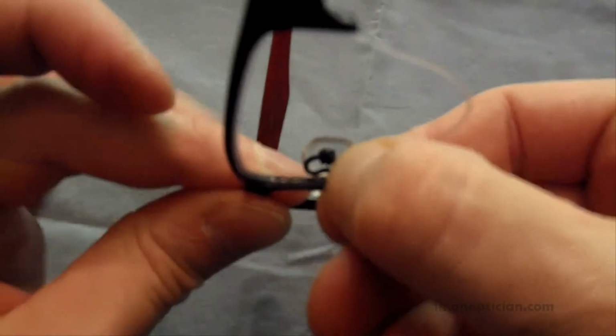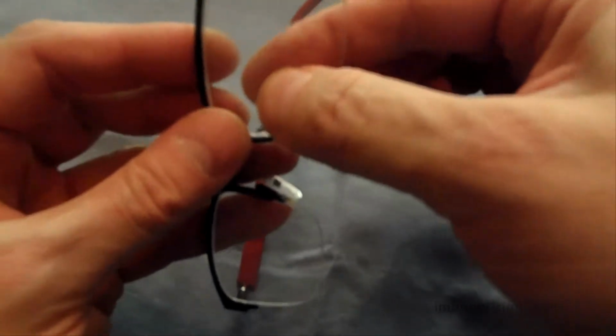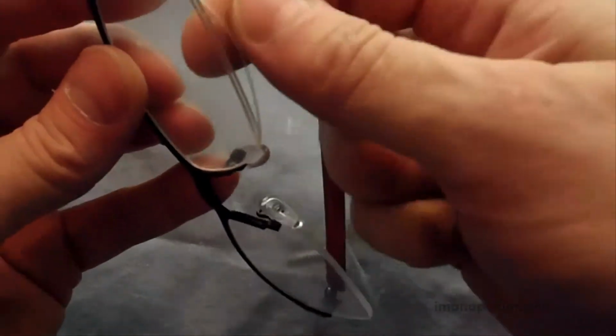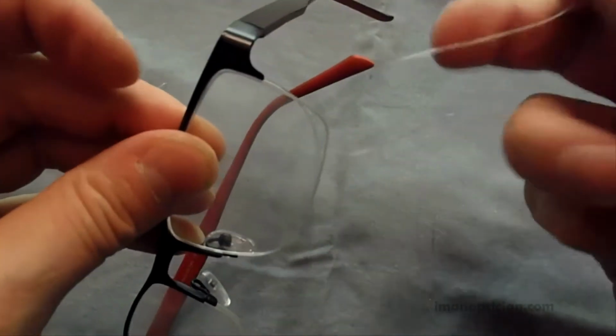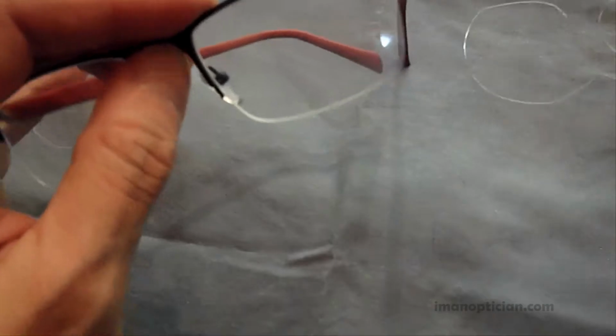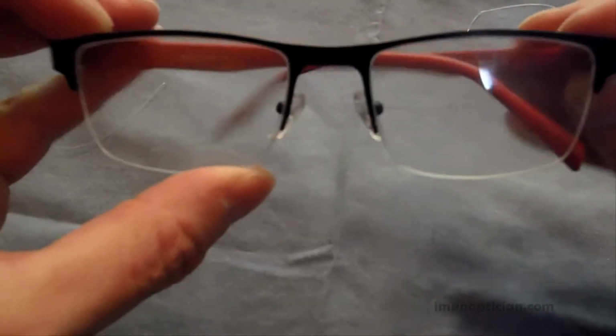Again, pull that down so that it seats into the little notch there, and make sure that our tag is not overlapping with our figure 8 liner in there. And now we just set this in. Again, make sure both tags are inside the groove, and then you can use your string, you can use your ribbon. If you like buying tools, you can buy a little hook tool to do this with. I like to use the string because there's always lots of it around. Snap it in, and that's a perfect fit, just like that, in just a couple of minutes.